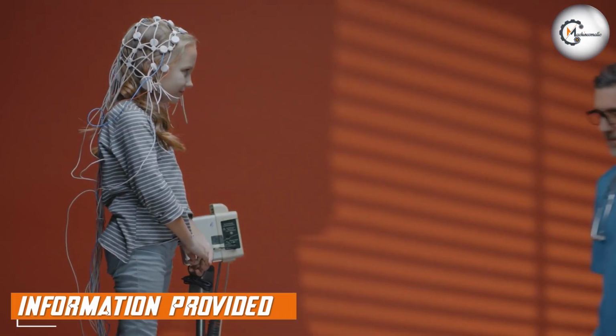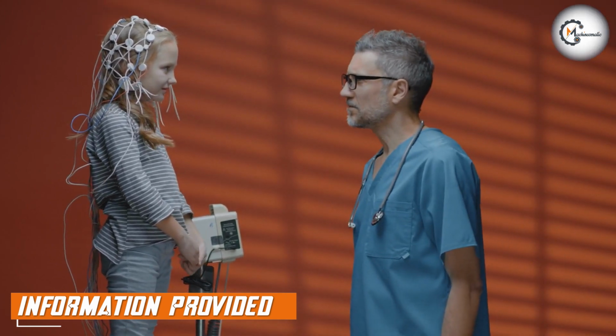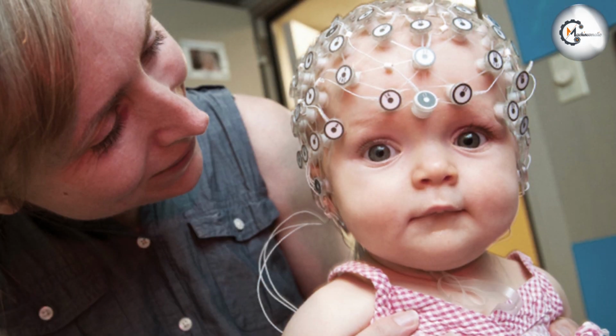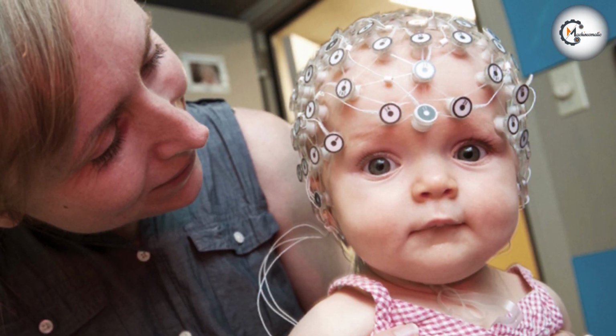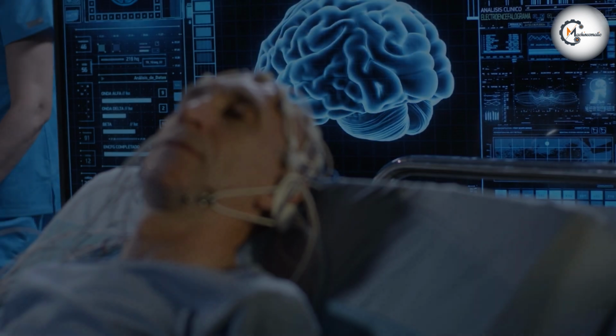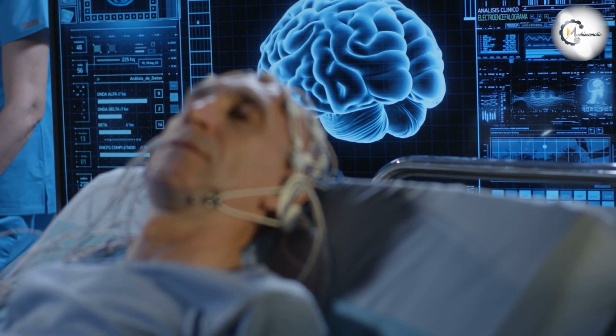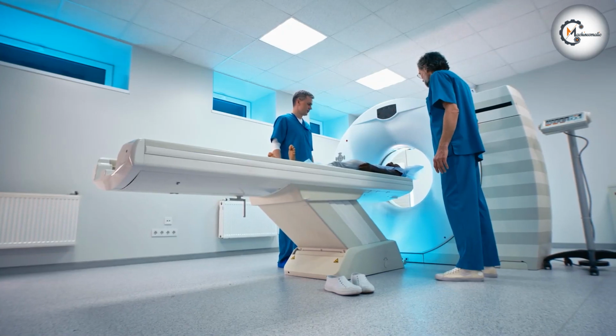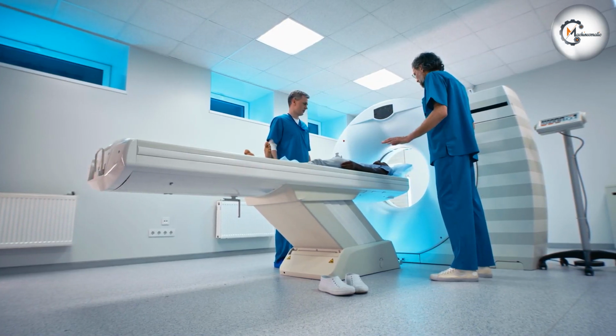EEG provides information about the electrical activity of the brain. This information can be used to detect abnormal brain activity, such as seizures or other neurological disorders. In the case of autism, EEG can be used to detect abnormal brain waves or patterns that may indicate a neurological issue. MRI, on the other hand, provides a detailed image of the brain structure.